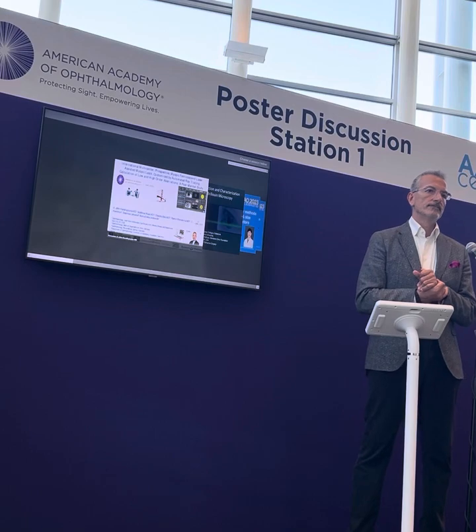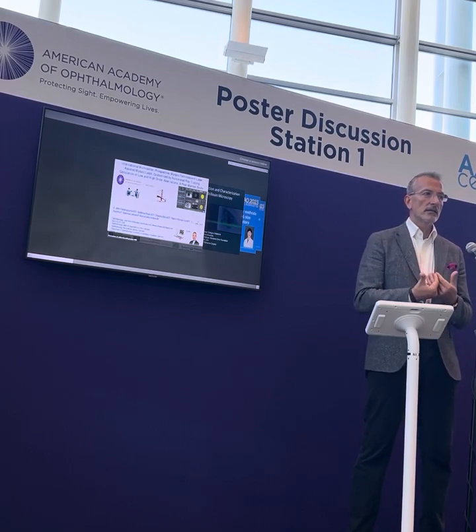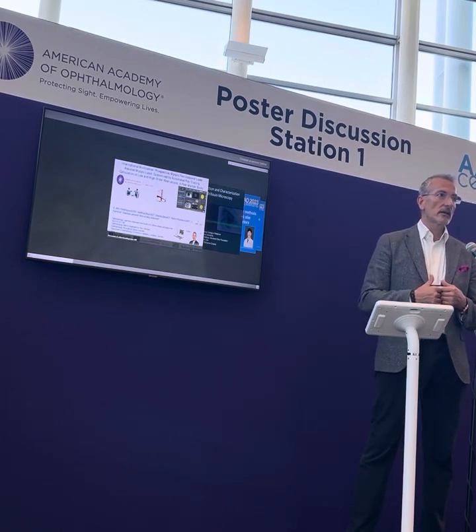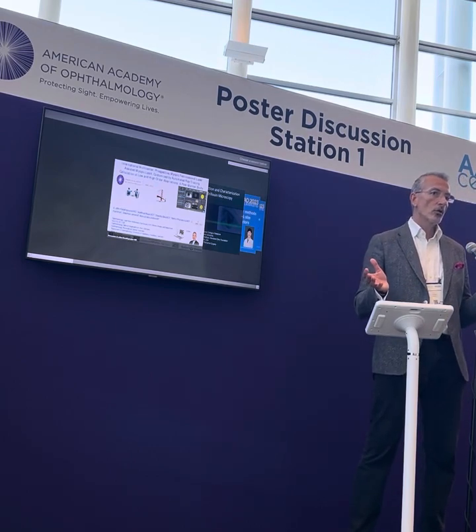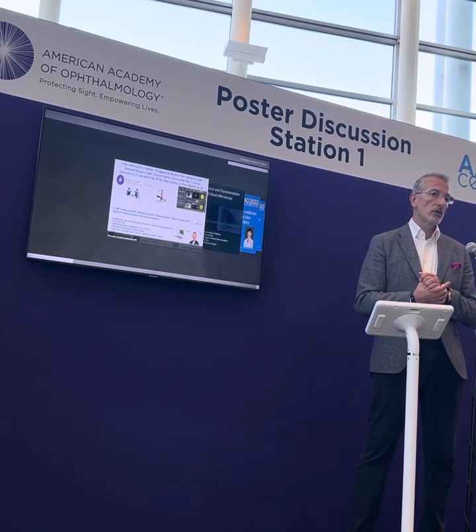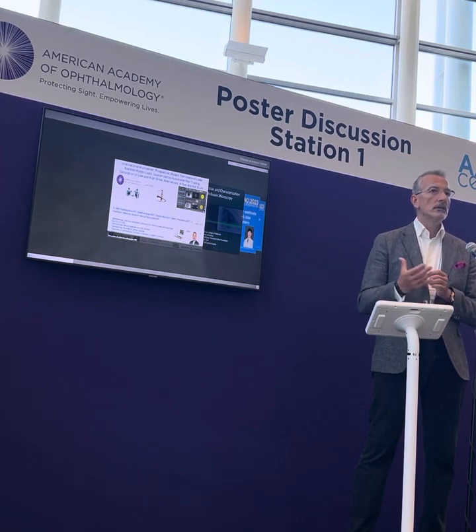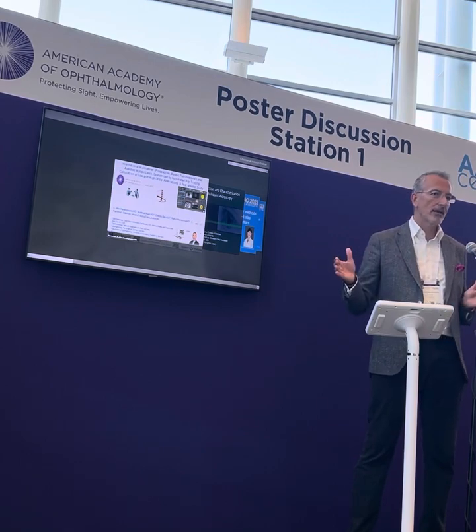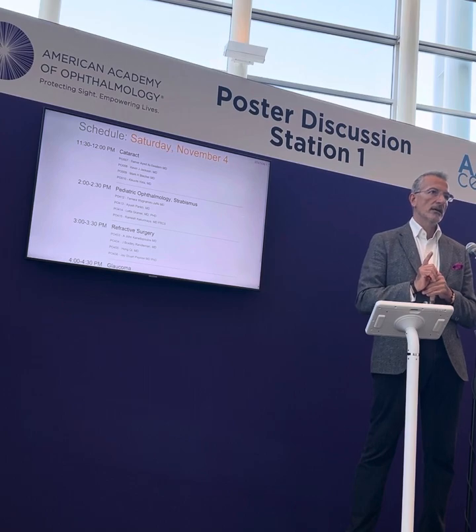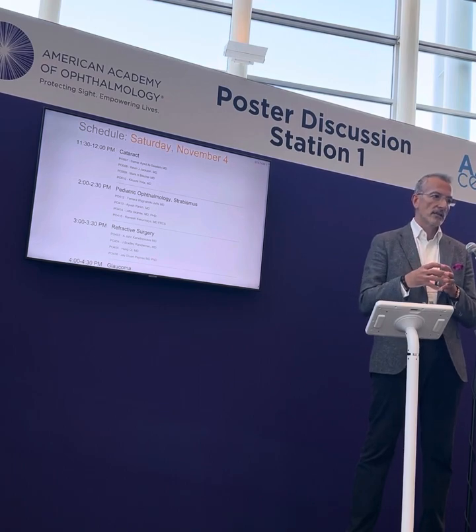Ideally, and this is a pearl outside the study, and this is not just a European study, this is a study from all over the world except the US. And I know the US study has similar preliminary data as well, kind of showing that this can work anywhere on the planet. But we have been working with using 1 drop of 0.5% tropicamide as the standard physiological state of the patient to be evaluated by this device and speed up the process.